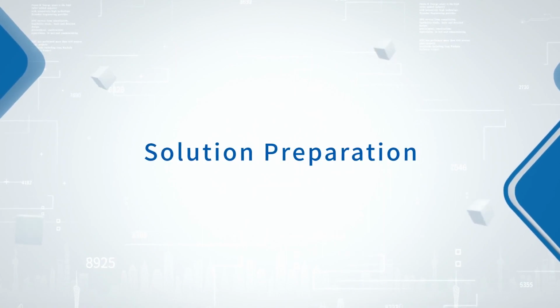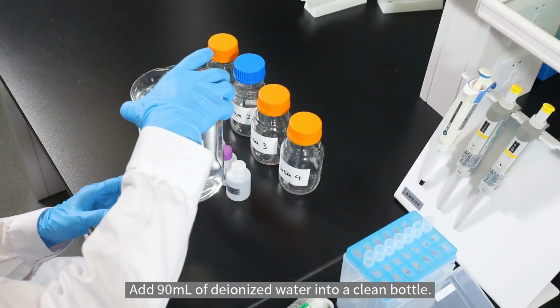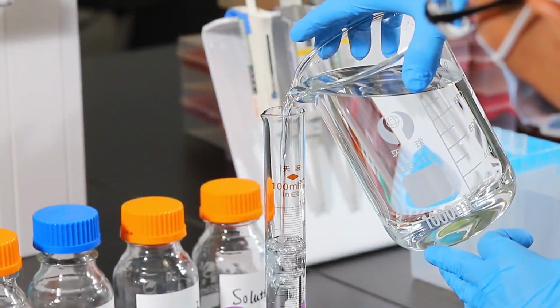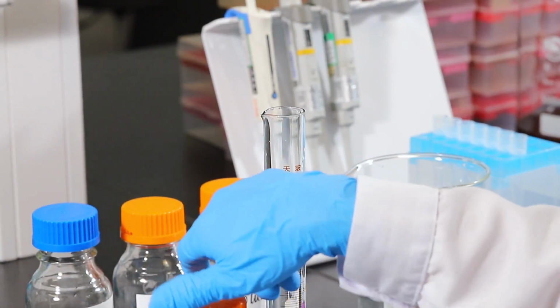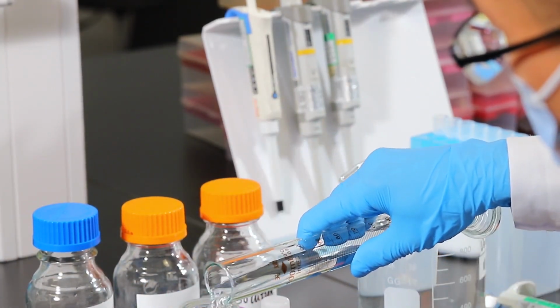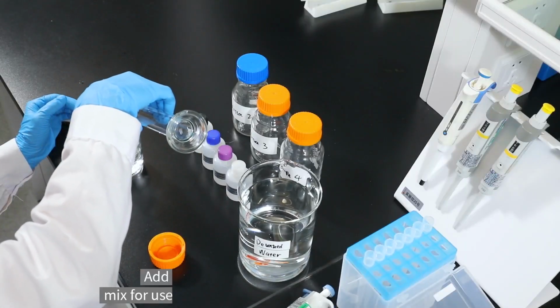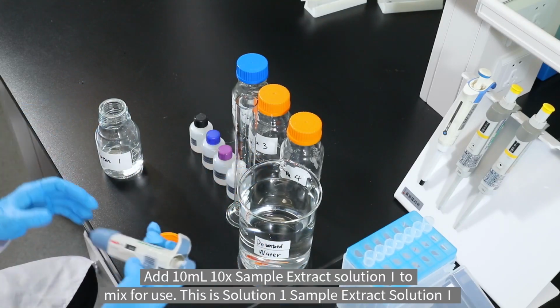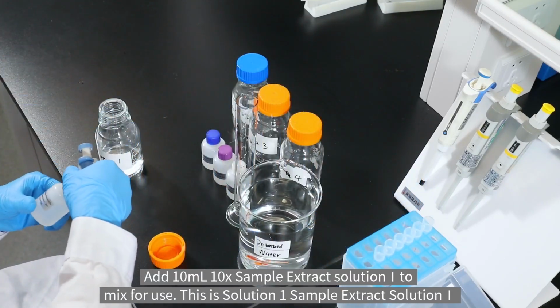Solution preparation. Add 90 ml of deionized water into a clean bottle. Add 10 ml 10 times sample extract solution 1 to mix for use. This is solution 1, sample extract solution 1.